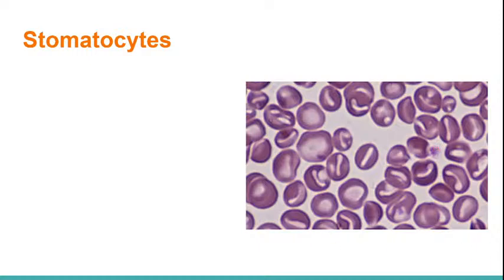And I'll show you later, because this is caused by artifactual formation. This is based on technicalities rather than actual disease states, which is the reason why I want my students to look at the feathery edge before looking at the thicker portion of the smears.